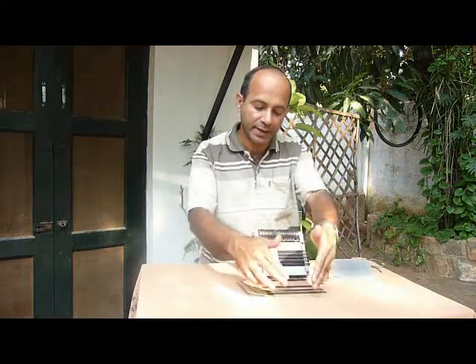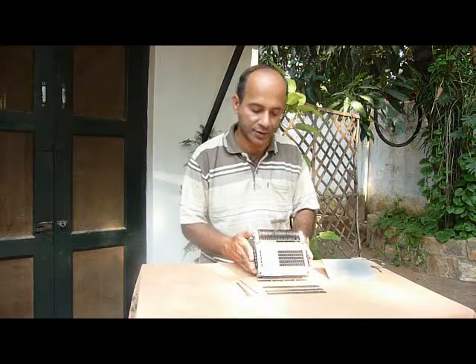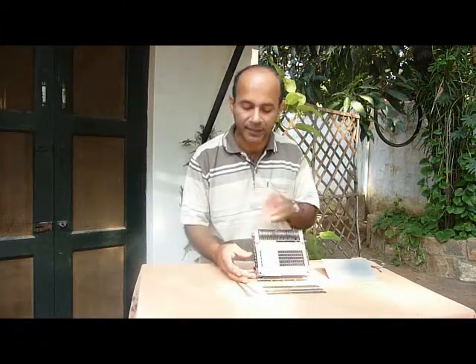Now if I increase the number of rows, the bank of cams would still remain the same. I just need a few more row actuators, three or four for every line that I add, if I'm using Braille cells, 6 or 8 dot Braille cells. So that's how there's a very significant, drastic reduction. A huge page, an 8-cell matrix, 25 lines, would still require only 100 actuators if a bank of cams is used.